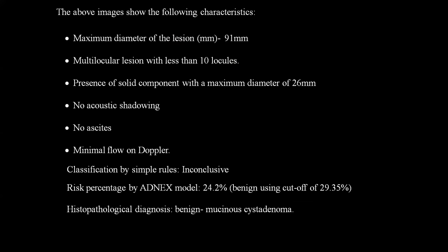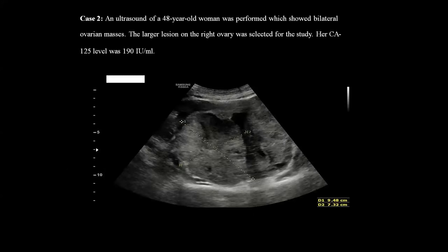The classification by the simple rules is inconclusive. The risk percentage by the ADNEX model is 24.2. The benign lesion cutoff was taken as 29.35, and the histopathological diagnosis of this lesion was benign, that is, a mucinous cystadenoma.